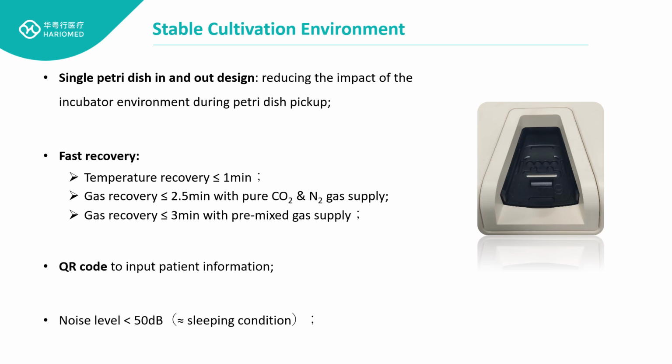On the top of the lid, a QR code scanner is here. So when the patient dish is put in with the label, the patient information will be recognized automatically. And the noise level is low.